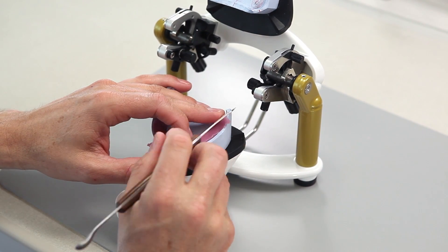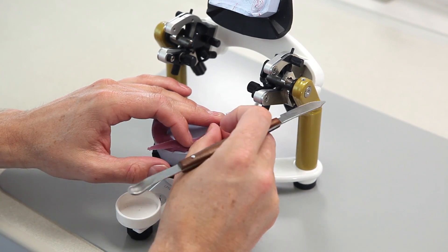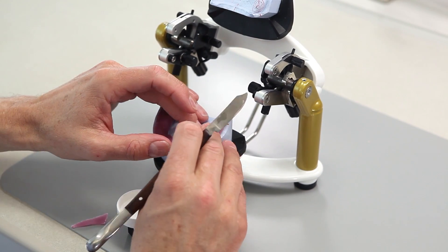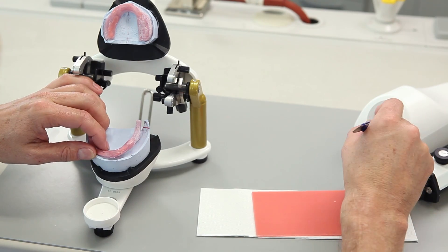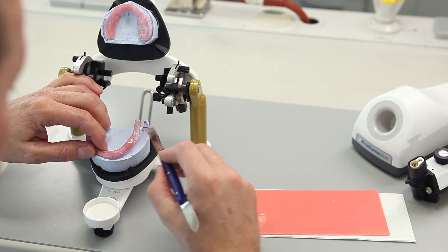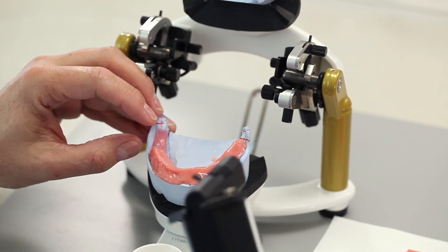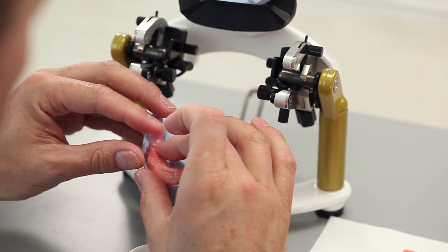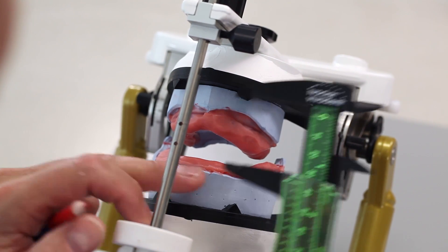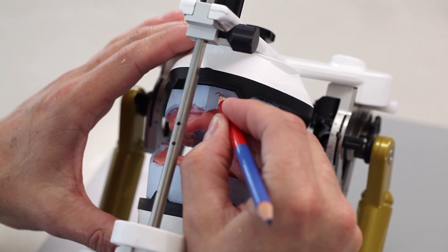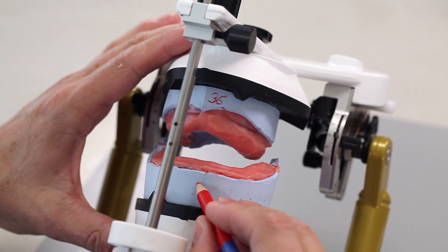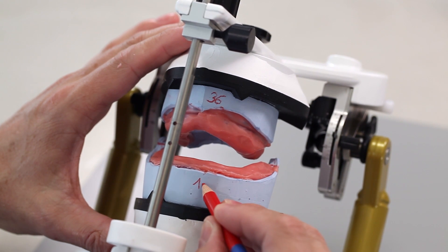Precise and stable resin plates made of tray material facilitate the try-in and prevent deformation. Ideally, use a hard wax with a high softening point for setting up the teeth. Determine the inter-vestibular distance and note down the value measured on the edge of the maxillary model and half the value on the edge of the mandibular model. In this way, you determine the position of the occlusal plane in the anterior region.